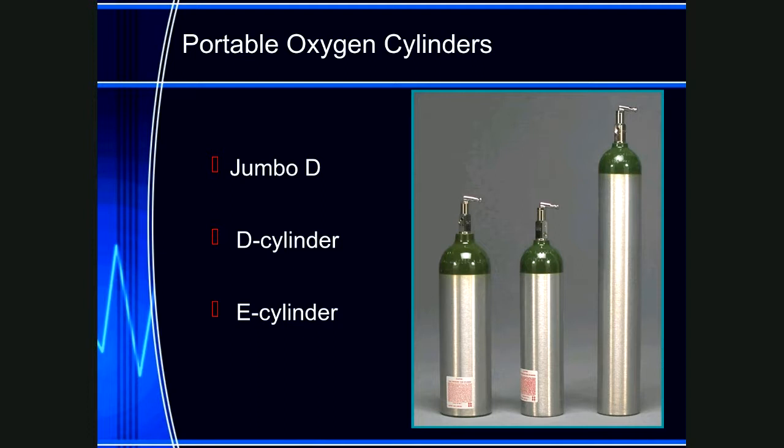So the key thing here to remember is 200 psi is the change out time, according to National Registry books and everything. But most of the time, out in the field, we'll change out our bottles at about 500. And 200 psi is the minimum pressure that could be used to run the oxygen to your patient. So remember, 200 psi is the correct answer on any test. Out in the field, it's 500 psi when we change out.